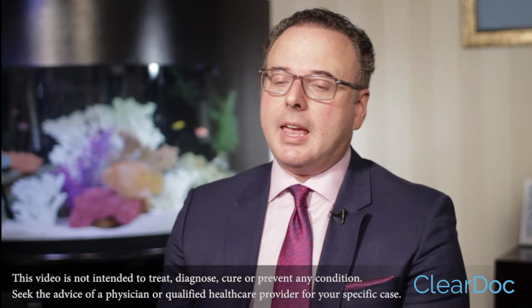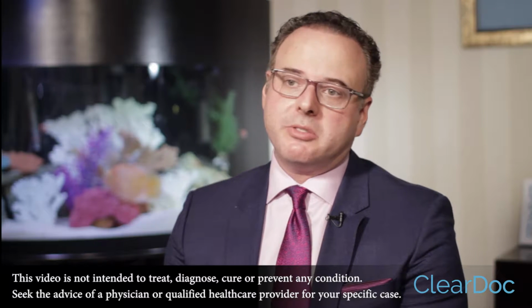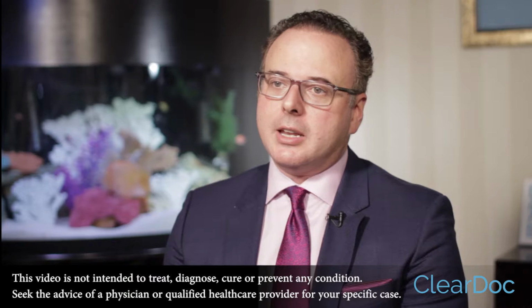So if a patient is referred to my office for an evaluation for a bone graft, the first part of the procedure is called a consultation, during which time I will evaluate the patient's concern and most likely take an x-ray. The x-ray I prefer to take in evaluation for a bone graft is called a CAT scan.